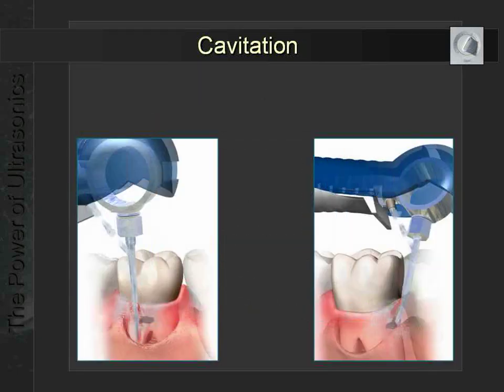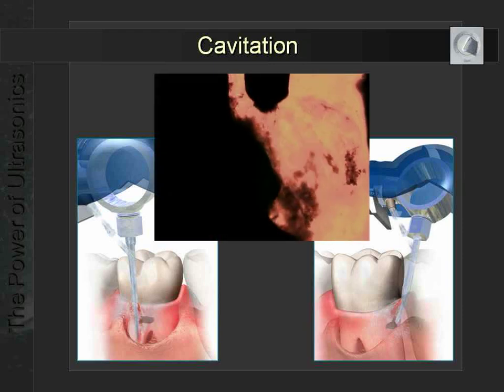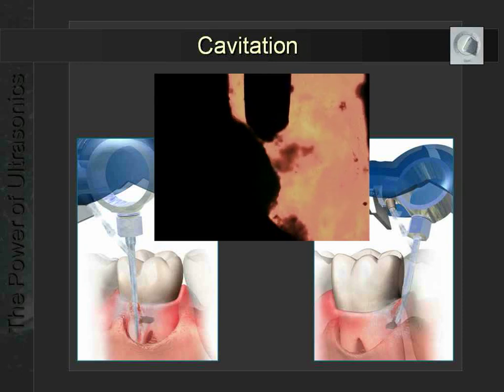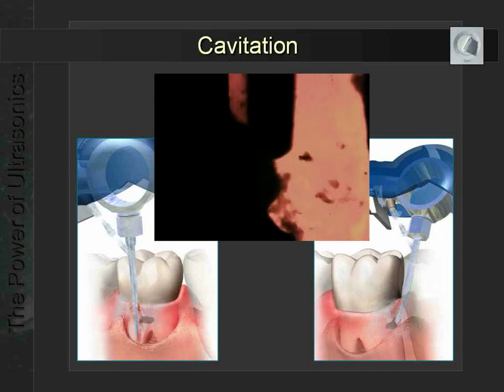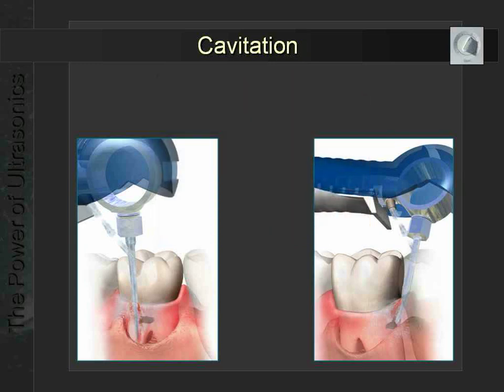Some companies go so far that they say, well, actually, you don't need to touch the tooth surface anymore. This is an ultrasonic brand that says what you're trying to create within a pocket is like what you would have with an ultrasonic bath. So you just stick in the tip, and then the probe does the rest. So this is the tip. This is the streaming. This is the cavitation which you have at this calculus on the surface. But I got this video from them. If you wait a little bit longer, you see what happens when they touch the surface. So now I'm convinced that you should touch the surface. And it doesn't work like they suggest that it works.